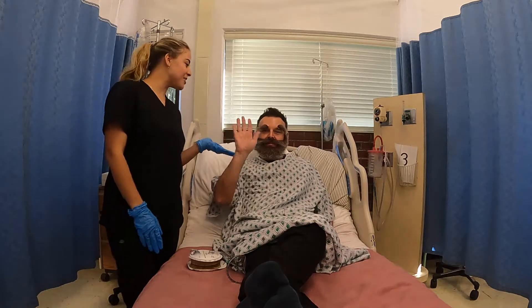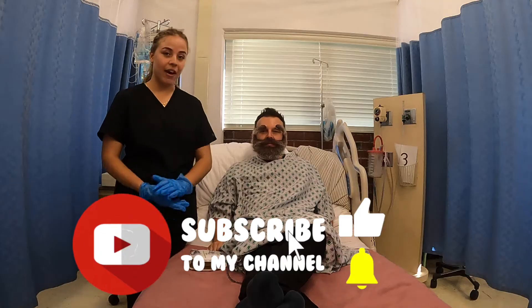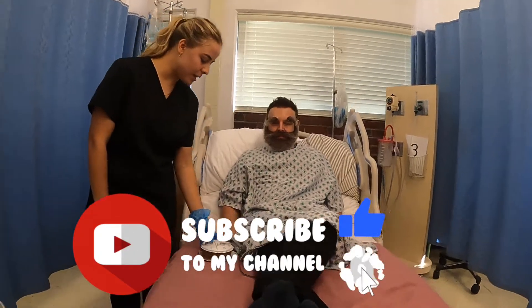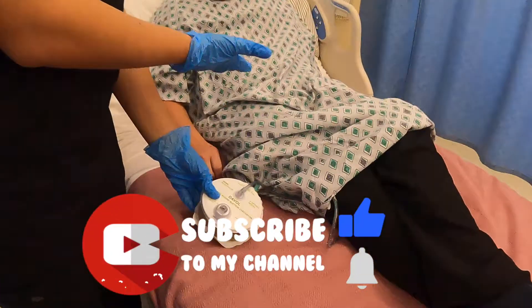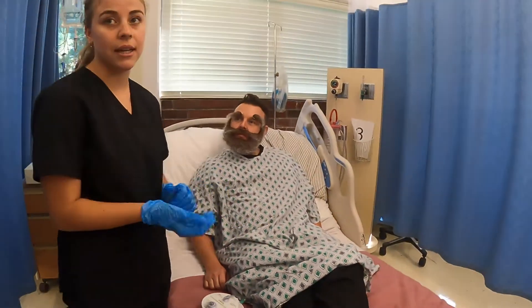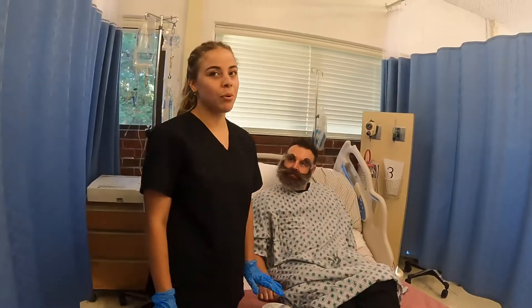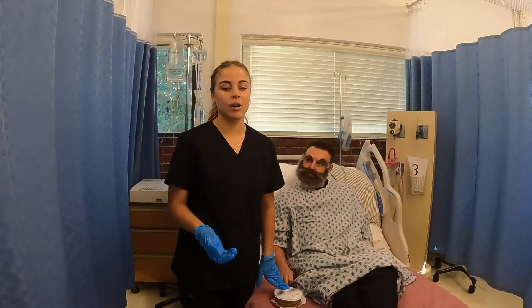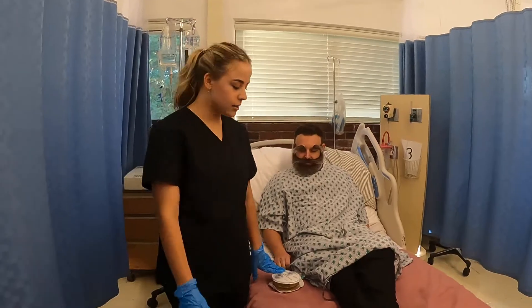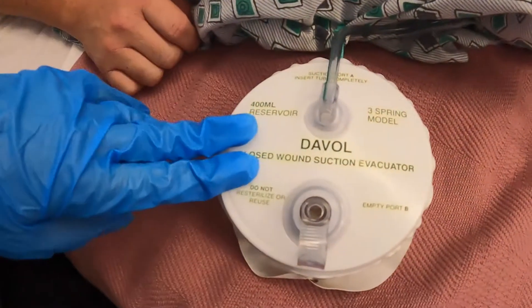Hi, it's nurse Samantha and this is my patient Hector. Today I'll be teaching you how to drain a Hemovac. Hector just had knee surgery so we're assuming he's going to be draining a lot of fluid. Compared to a Jackson Pratt drain, also known as a JP drain, which holds 100 milliliters, the Hemovac holds 400 milliliters — a much bigger reservoir.